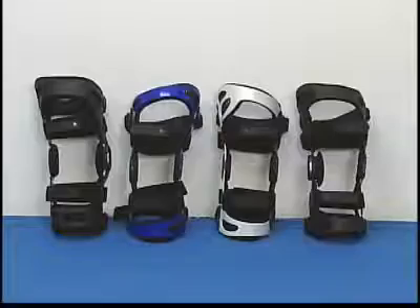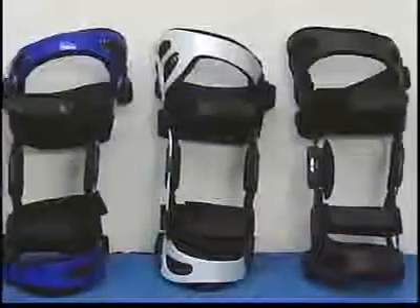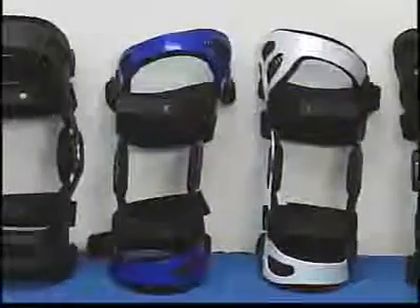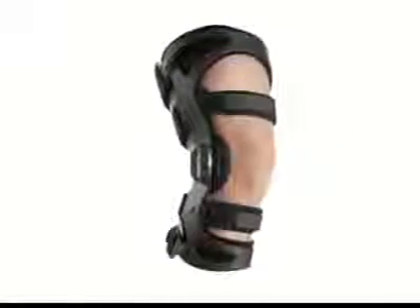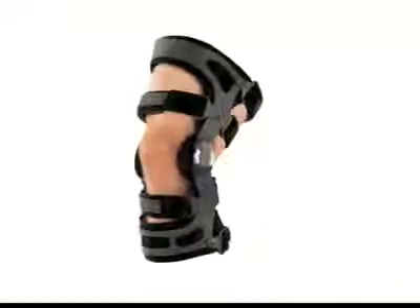Bregg's Fusion Knee Braces are designed to provide support, stabilization, and pain relief for patients who need ligament support or who are suffering from unicompartmental osteoarthritis on one side of the knee or the other.